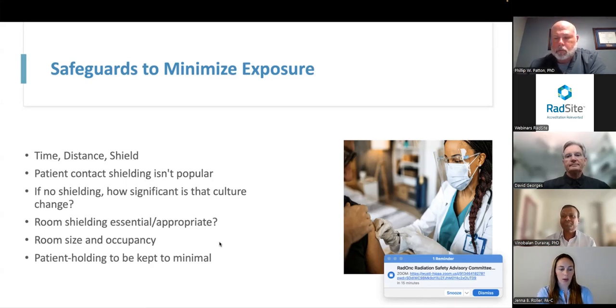Yeah, I think you bring up a really good point. We have a number of accessories that we provide with our scanners to try to mitigate the need for that, to try to really limit the exposure to the technologist. One of our most common areas is in the pediatric space, and it's more that there is an adult chaperone. So it may be that there is a child that's apprehensive or someone who's in pain. And then those facilities typically defer to their existing policies and procedures around having other people around. But we use a lot of strapping, a lot of accessories. We have some stabilizing devices that we have designed to really help keep that at a minimum.